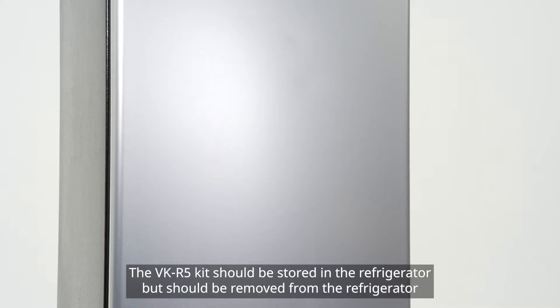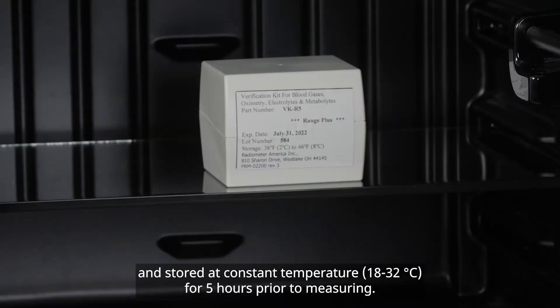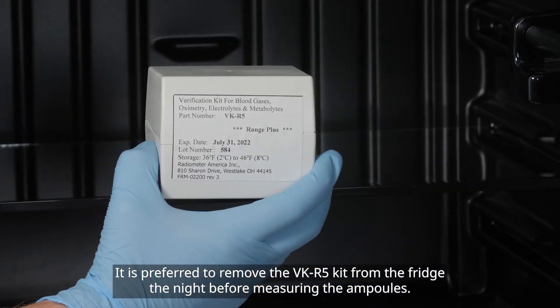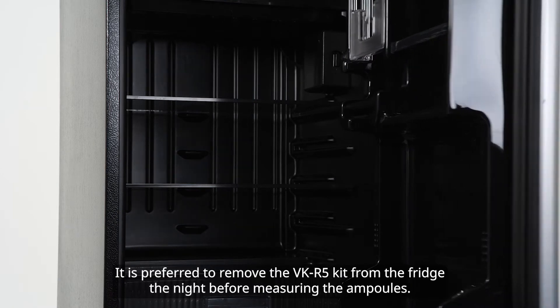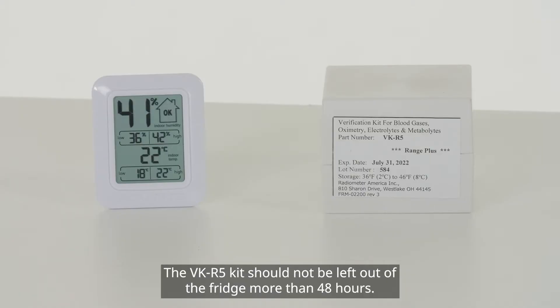The VK-R5 kit should be stored in the refrigerator, but should be removed from the refrigerator and stored at a constant temperature of 18 to 32 degrees Celsius for five hours prior to measuring. It is preferred to remove the VK-R5 kit from the fridge the night before measuring the ampoules. The VK-R5 kit should not be left out of the fridge more than 48 hours.